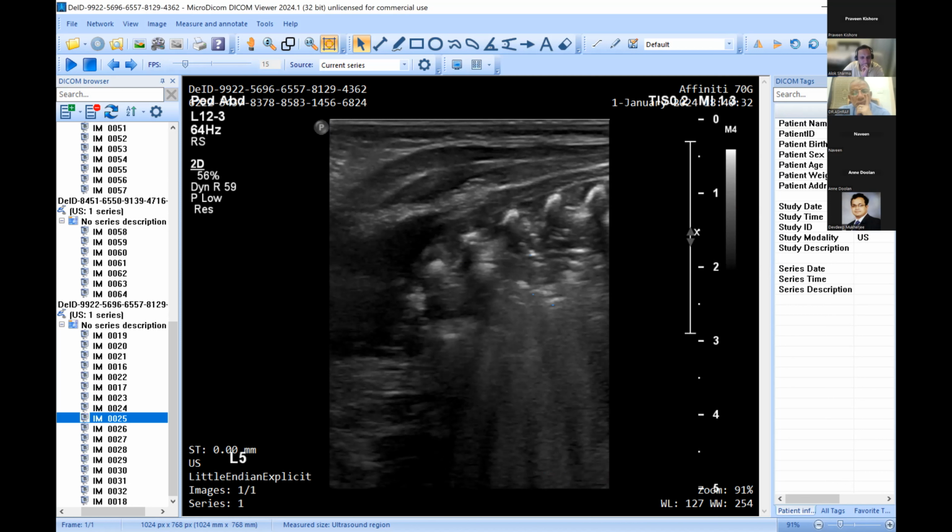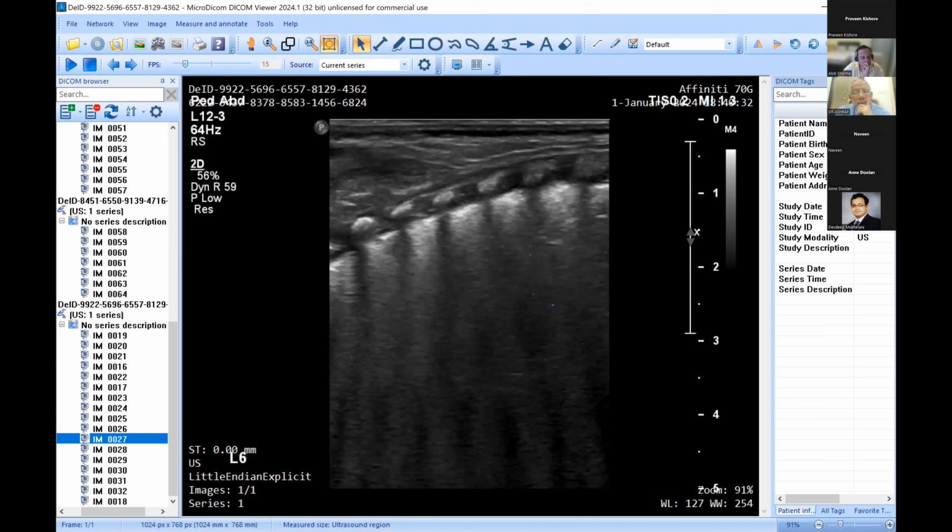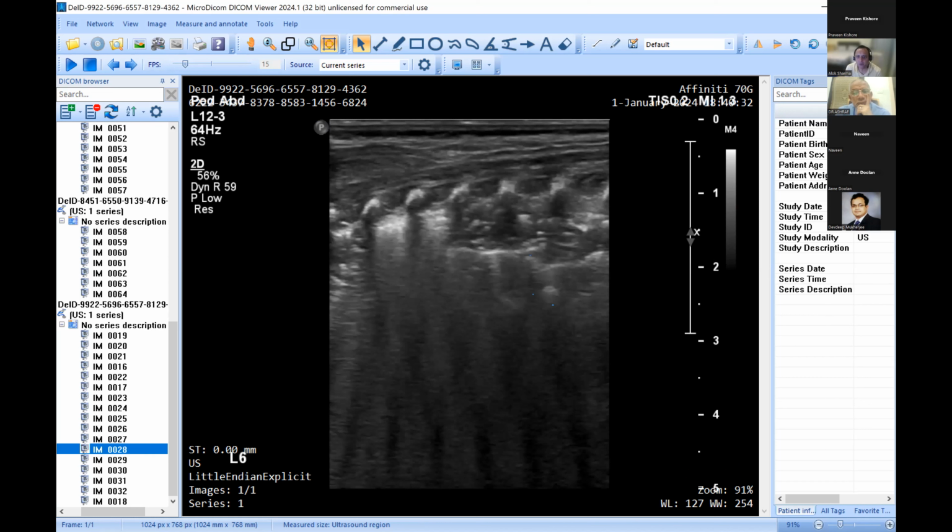Could I just ask, if you have an ex-prem like this one and they are older now, if you had BPD with cystic changes, would it appear on lung ultrasound, and would it appear like a small, localized region of... No, it wouldn't. Again, it's very similar to the question I get asked about PIE.